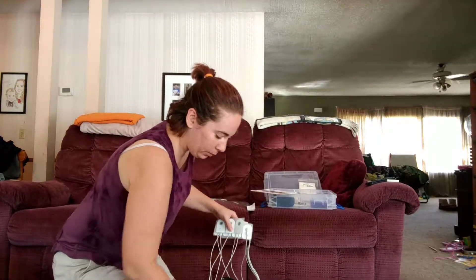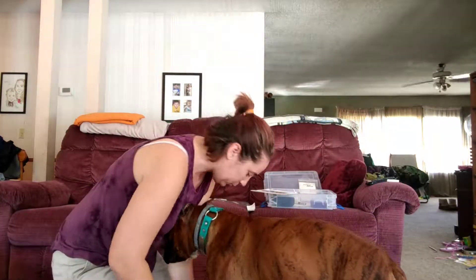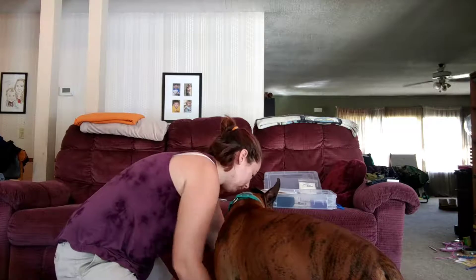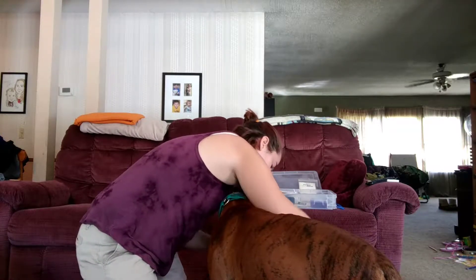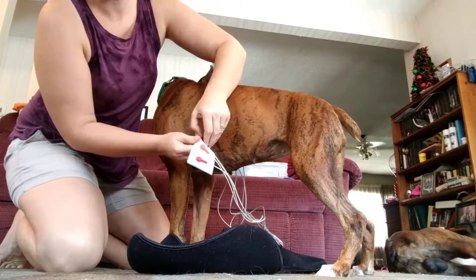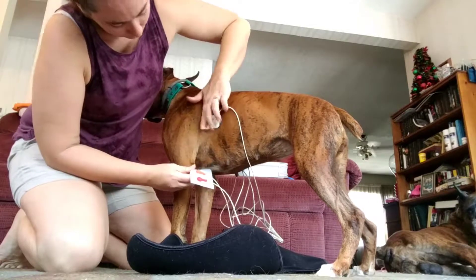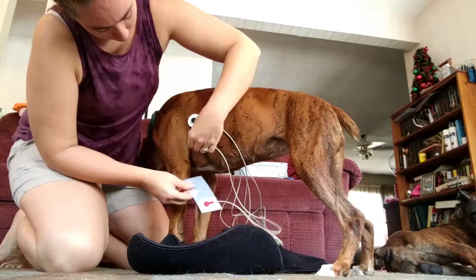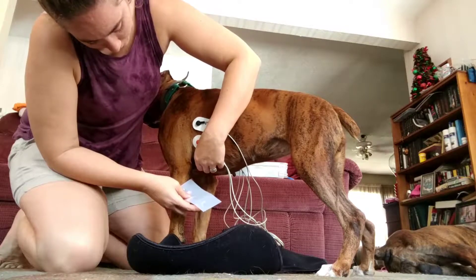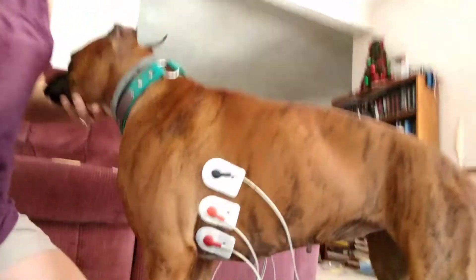Lay it down — good girl — and go ahead and stick their feet through the little holes. It says to do the black first, or just start at the higher point.